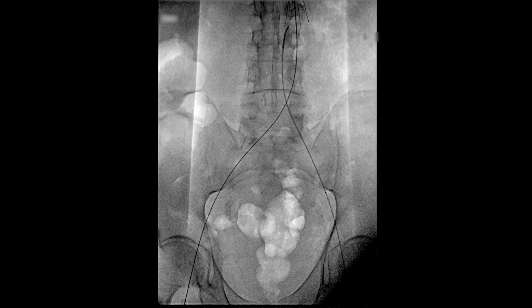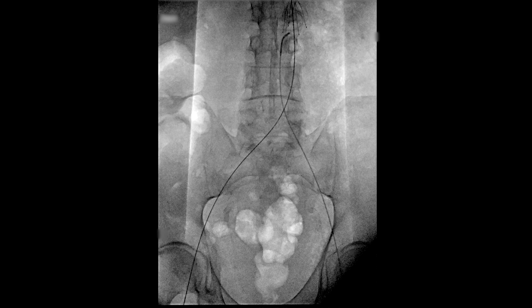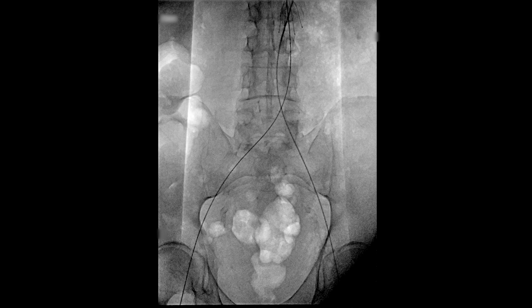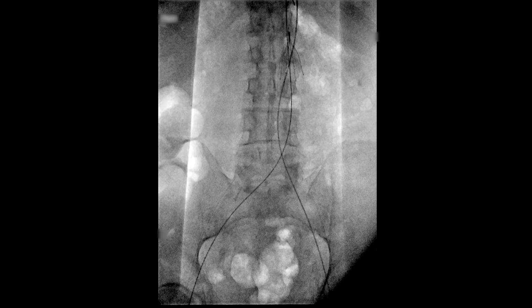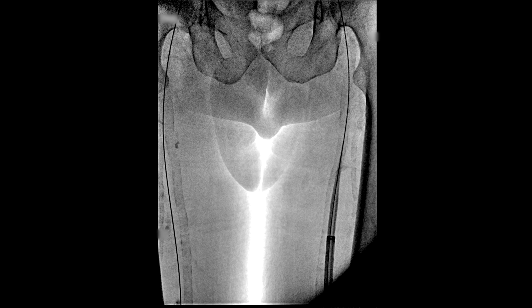Once the wire is in the inferior vena cava, the catheter follows quickly, and then we bring our wire up through the IVC filter and bring it into the suprarenal IVC. Once we have our wires in the inferior vena cava, we then introduce our first thrombectomy device.